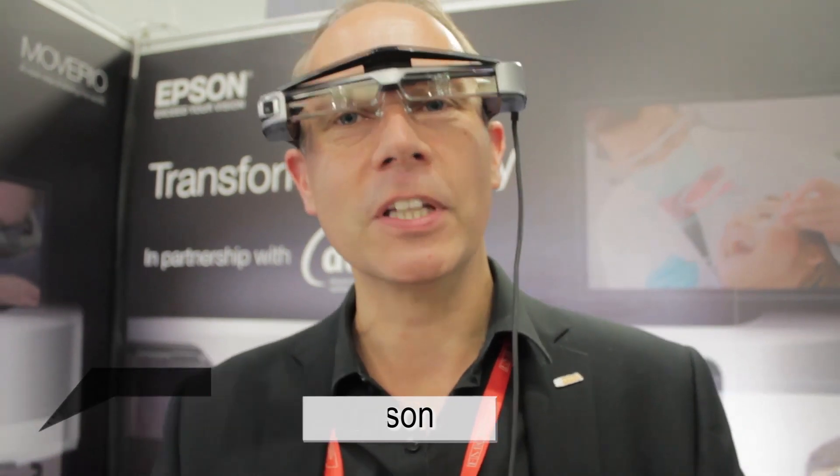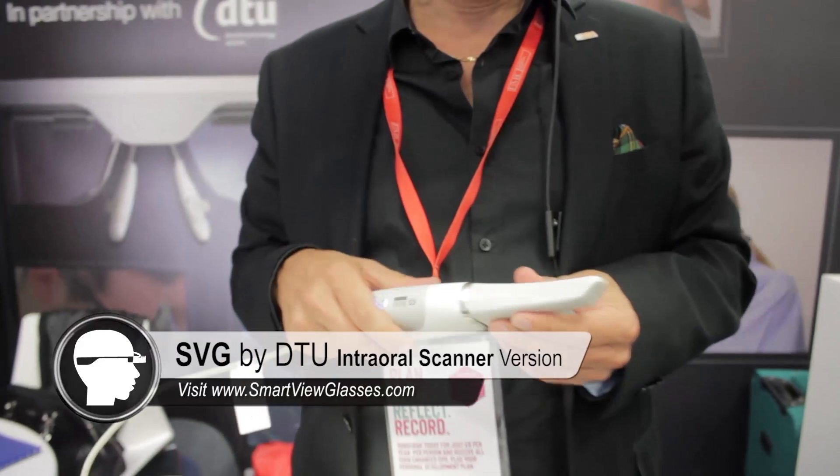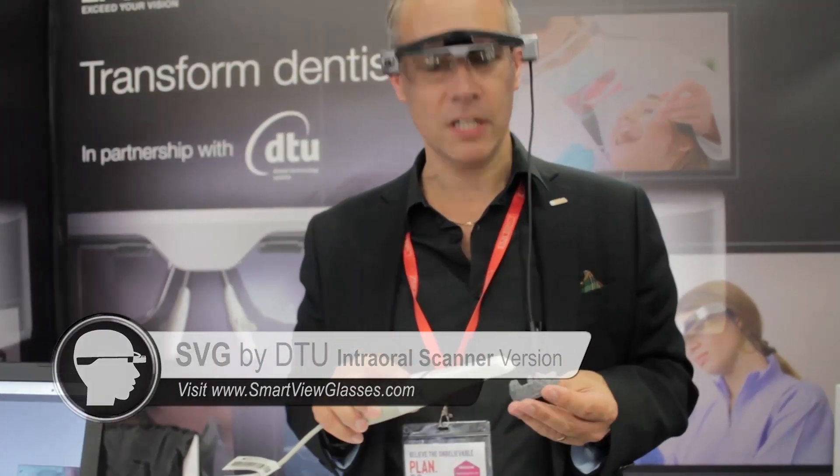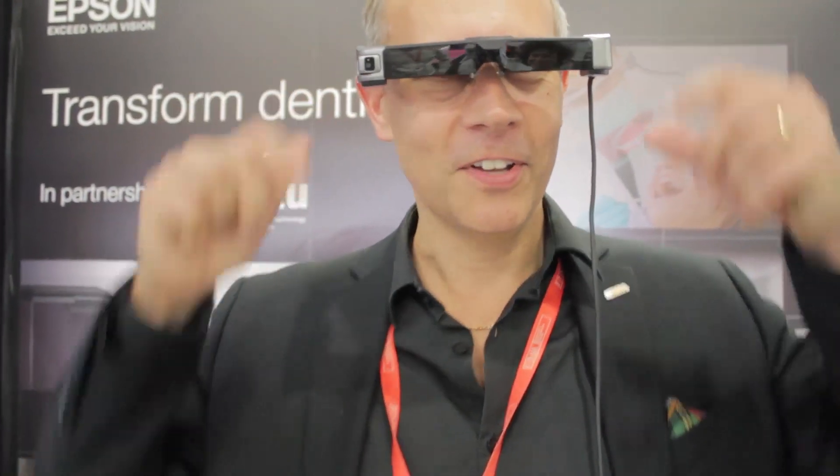It's a fantastic product and we looked at this at the IDS showcase earlier on. Now it's really come to the market in the UK and I'm really looking forward to using this in my practice — with both Carestream and with Omnicam. I think this will really revolutionise the way I'm working, and in a teaching situation it brings it to a different level. The patients will love it as well, especially in dark mode. The two uses of these vision glasses is amazing — this is the first time I've been able to watch 3D in a supine position. The clarity and ease of use of the scanner is absolutely amazing. Thank you very much.